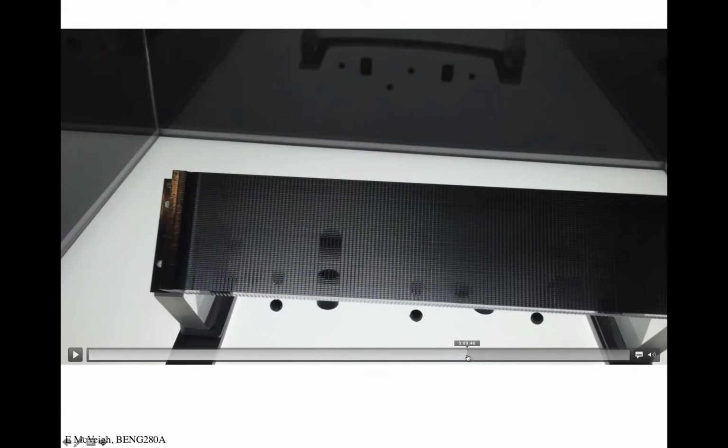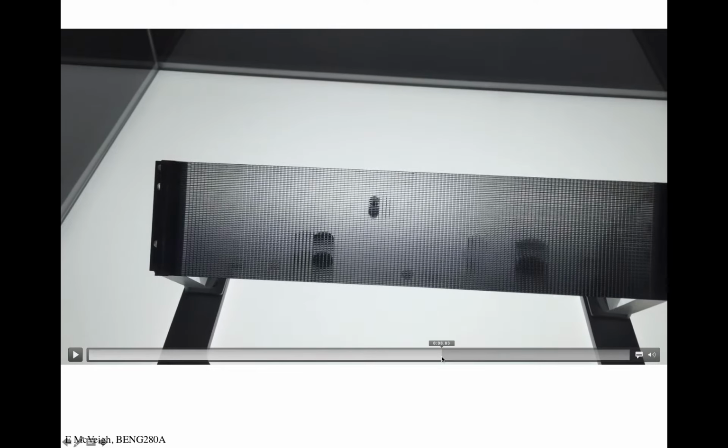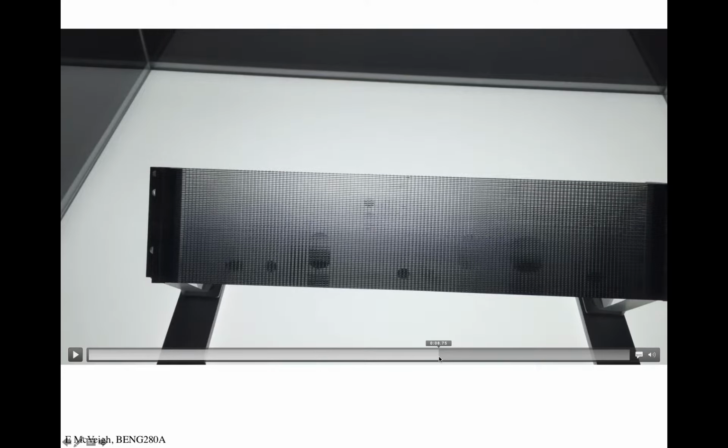There are these dark objects on a backlight, and then you tip over, and you can see there's a primary image there, and if you get off to an angle, it basically disappears, right? When you're looking through, you can see there are walls and cells, and you want just the X-ray coming through the cell cleanly. If it's at an angle, it's going to hit a wall and get absorbed.